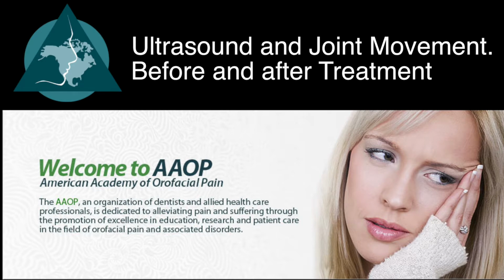Yeah, so from that standpoint, it's a really good learning tool, and for the patient too. You can even show the patient. So you could use it educationally, like I do often, for things like translation. You can show them how the bump, that lateral condyle, is moving all the way across the screen on one side, and on the other side it barely even moves. You say, see that? That's your jaw. It's not really moving. I wouldn't make a diagnosis on that, but it helps to solidify what you're thinking.